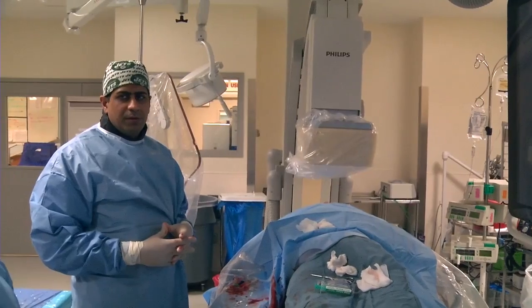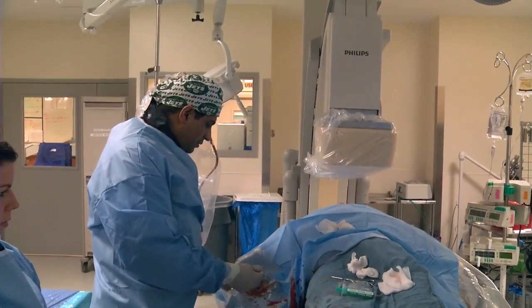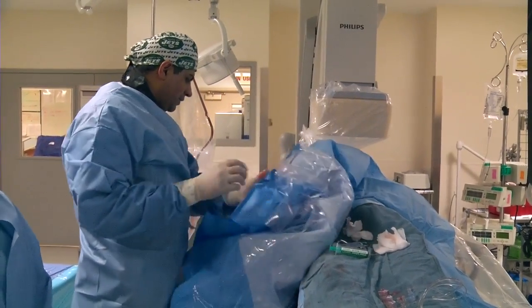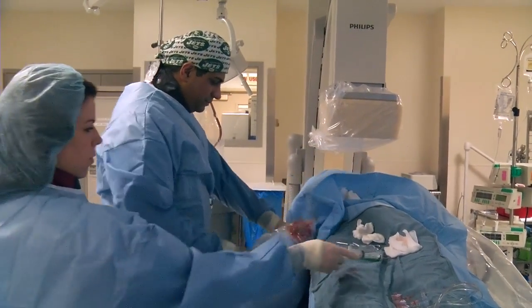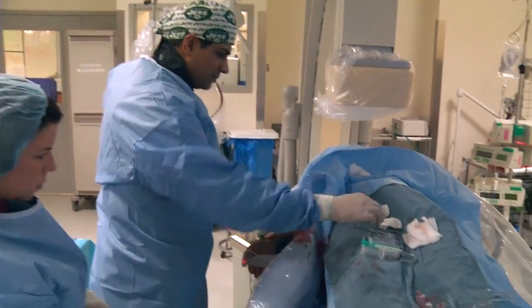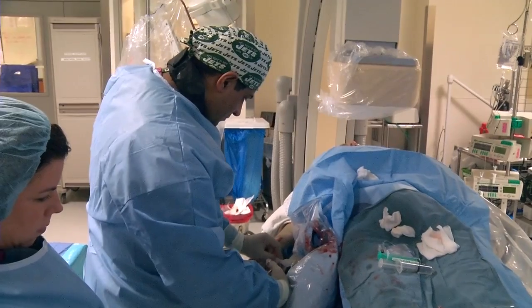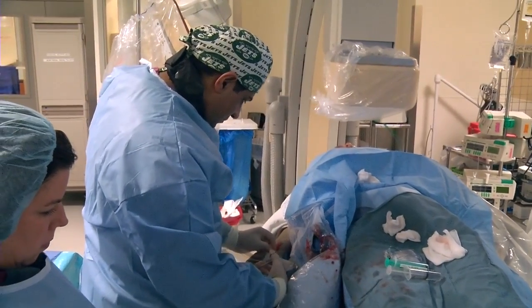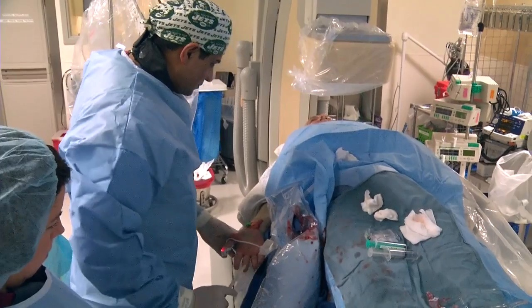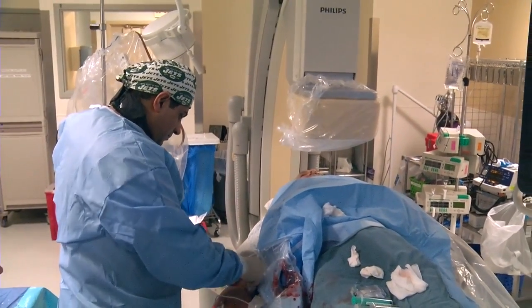Now we're going to go over sheath management post-procedure. So I'm going to break sterility over here. Clean off the heme.